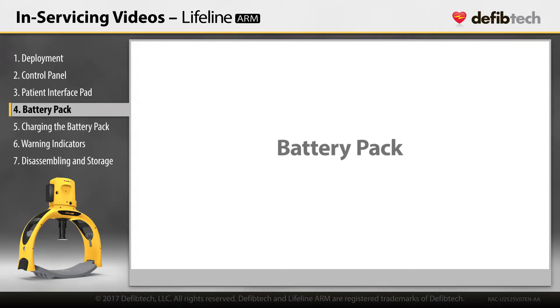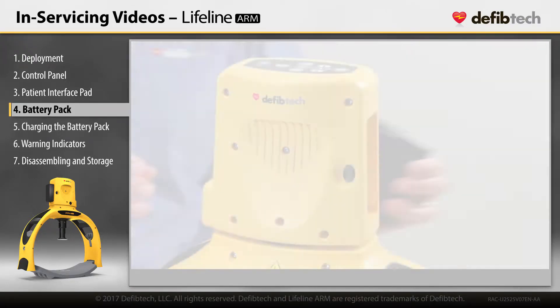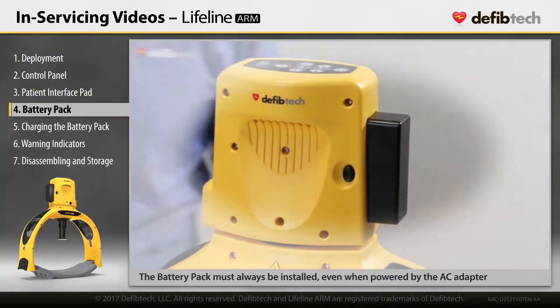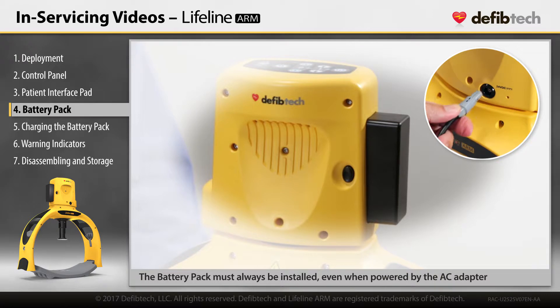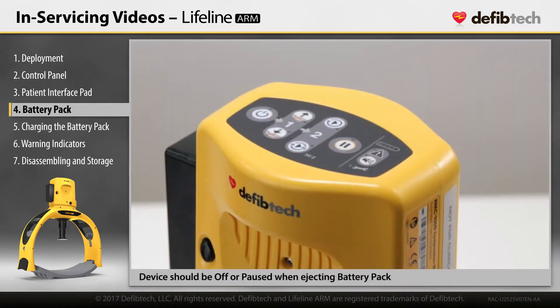Battery Pack. The battery pack must always be installed in the unit in order to operate the device, even when powered by the AC adapter. The device should be turned off or paused if in use whenever swapping out batteries.